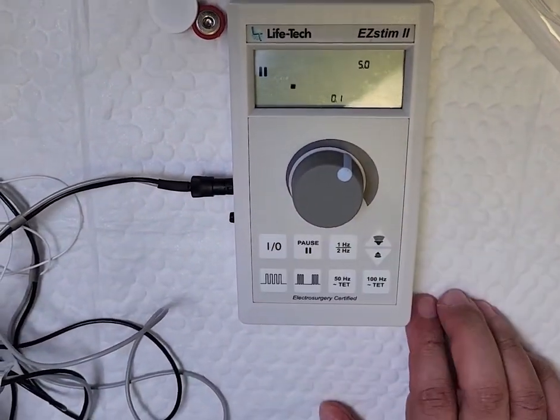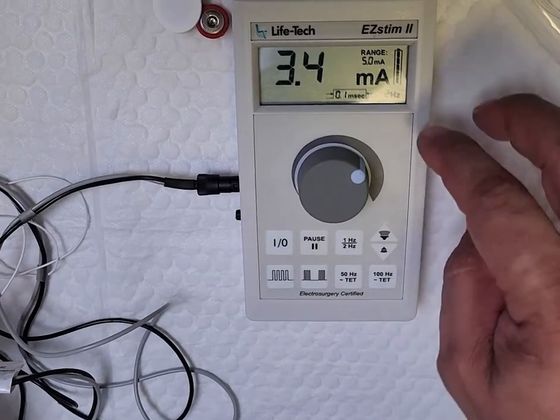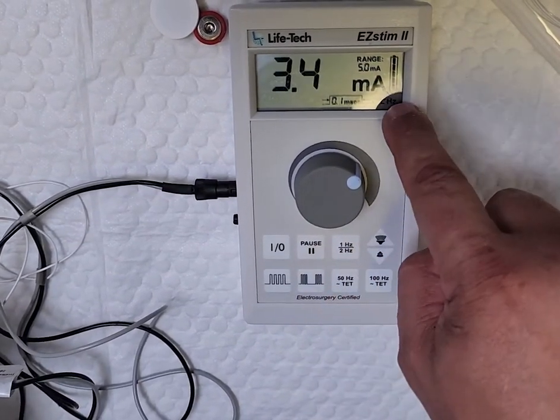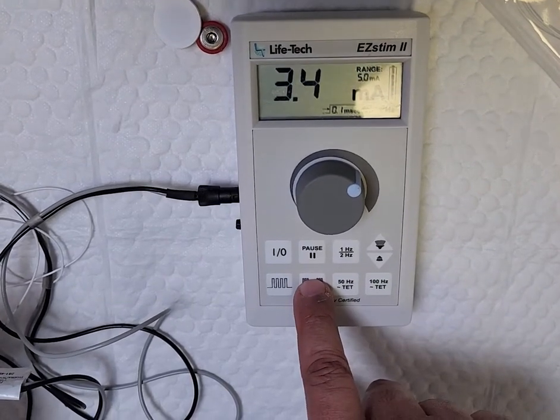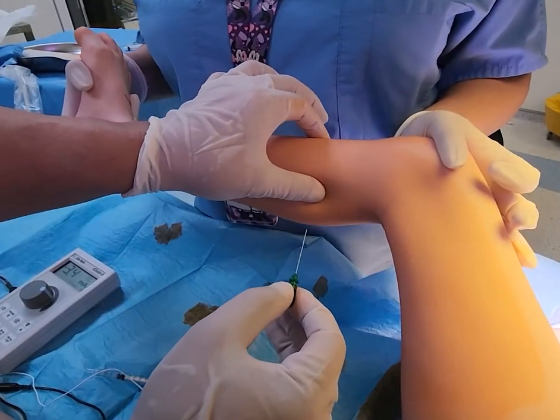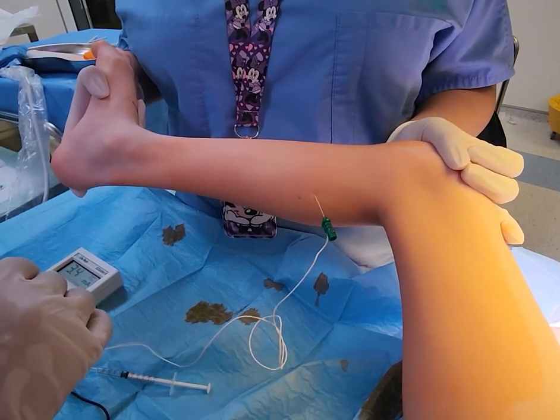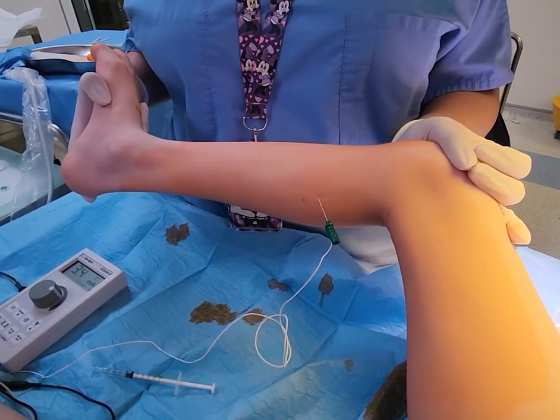The device is switched on or off from the small square button. We can adjust the milliamps — it ranges from 0 to 5 mA, and I usually set it to 3.4. It can be paused, and it comes in two frequencies: 1 Hz and 2 Hz, switchable from the button. You can also choose continuous or interrupted pulses. After sterilizing the skin and identifying the muscle, we insert the device needle, check manually that it's inside the muscle, then check it electrically. As you can see, the gastrocnemius muscle contracts and pushes the foot downward — confirming we are in the right muscle.